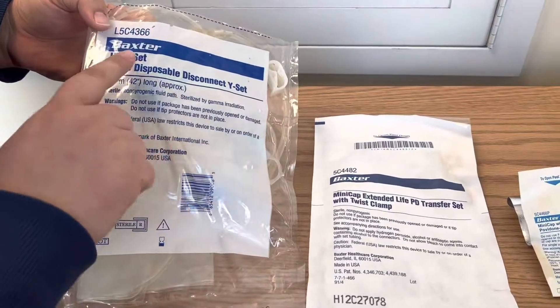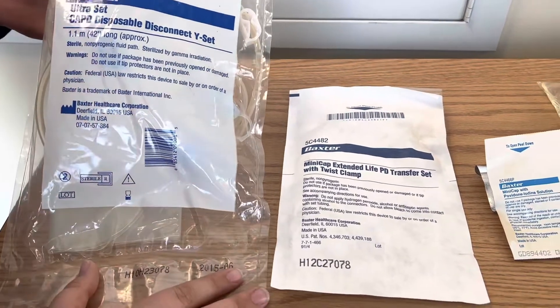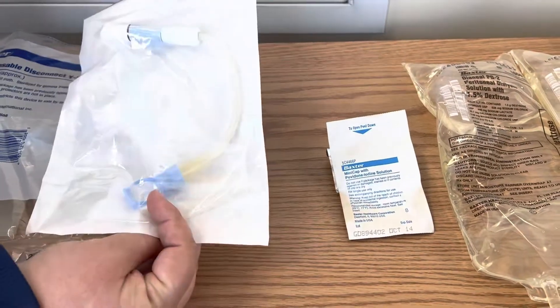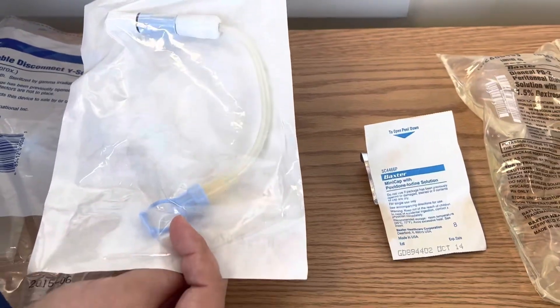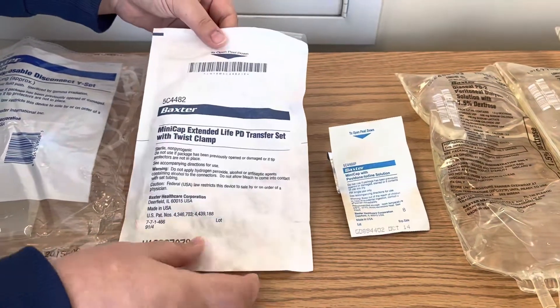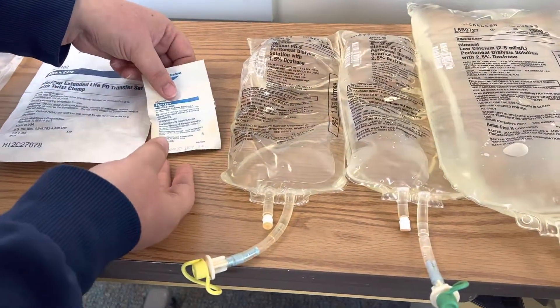You want to make sure you have an ultra set CAPD disposable disconnect Y set. Occasionally you may need the PD transfer set. Sometimes this gets clogged and we need a new one, so this is available as well, but we don't typically need that for every single exchange.